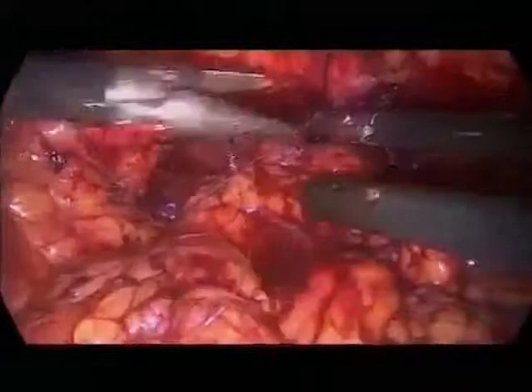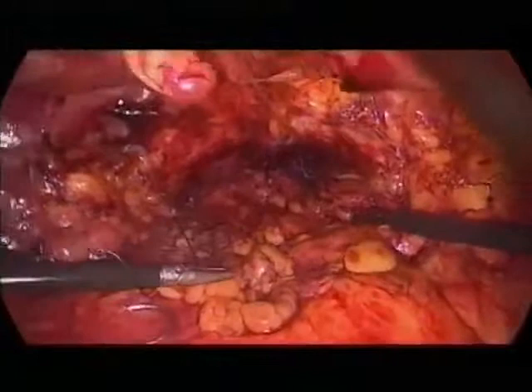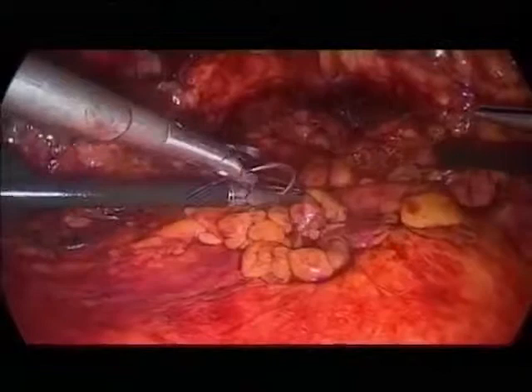Okay, come in. Okay. Oh, it's losing a little bit. Ich bin abgerutscht. Okay. Too much. So, and the final stitch is at 1 o'clock. Come in.